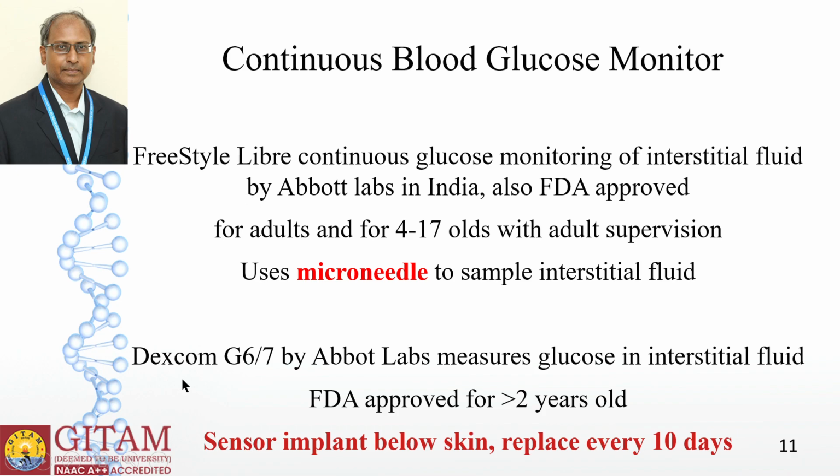These are some minimally invasive devices. As we said, minimally invasive devices will not qualify for this competition. However, these are commercially available. This FreeStyle Libre is approved for adults, also for 4 to 17 years old, and the Dexcom G6 or G7 is approved for greater than 2 years old. However, none of these is yet approved for neonates.